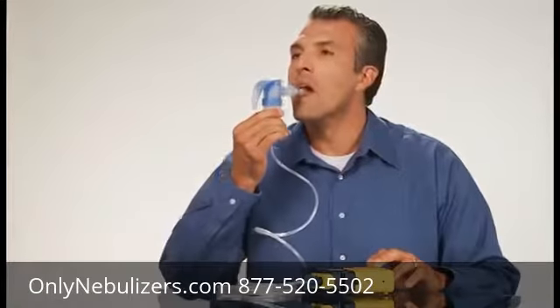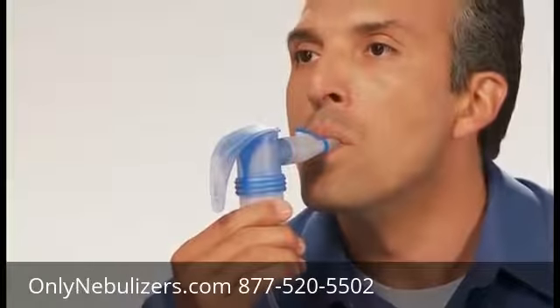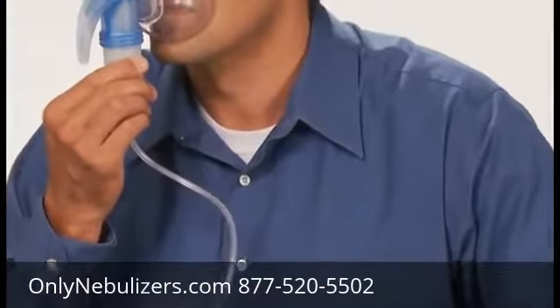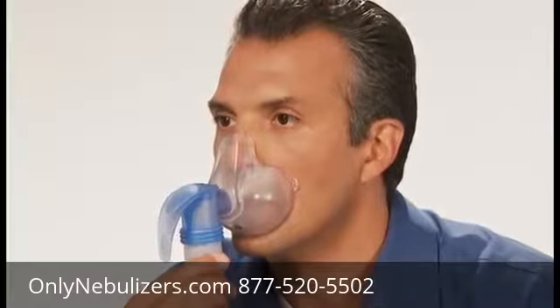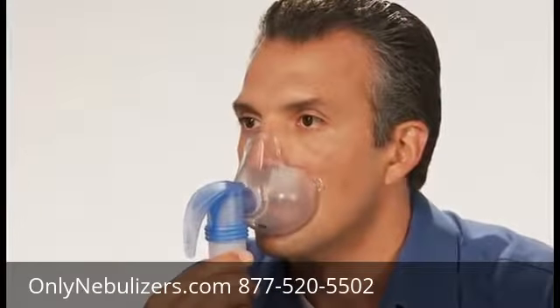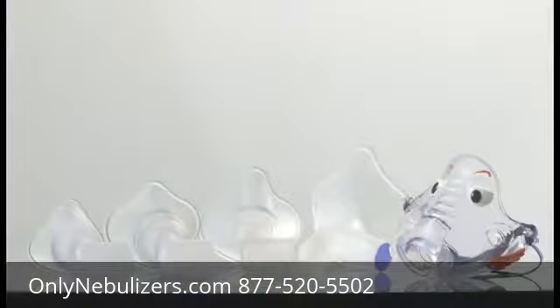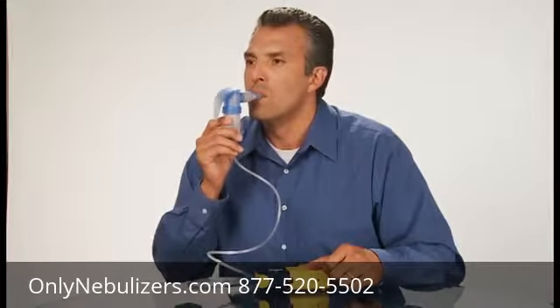You are now ready to start your aerosol therapy. Sit and relax in an upright position and turn the power switch on. Place the mouthpiece on top of your tongue and close your lips around it. Take slow, deep breaths to inhale the aerosol. Exhale slowly through your mouth. If using a mask, place the mask over the nose and mouth, then inhale and exhale slowly. Be sure that the inspiratory valve cap is closed or in the down position. Follow the same steps if using the Bubbles the Fish 2 pediatric mask or the Pari baby masks. Continue your treatment until the medication is gone or you hear a sputtering sound from your nebulizer cup.